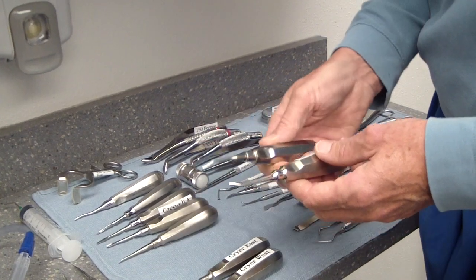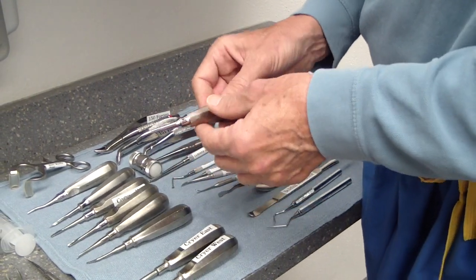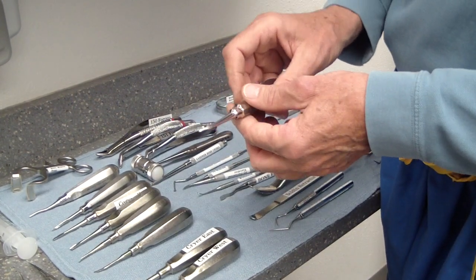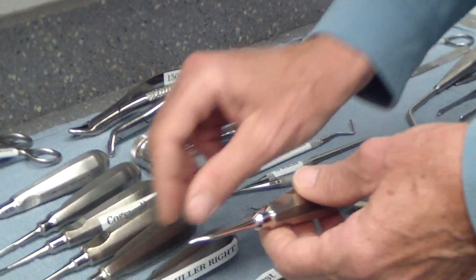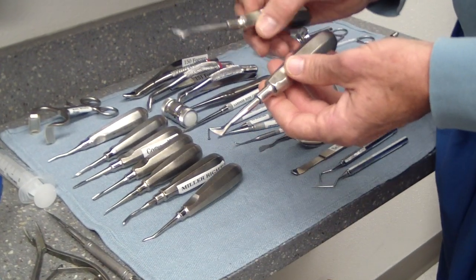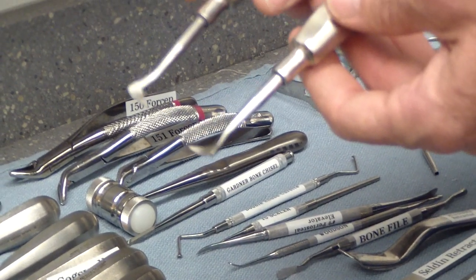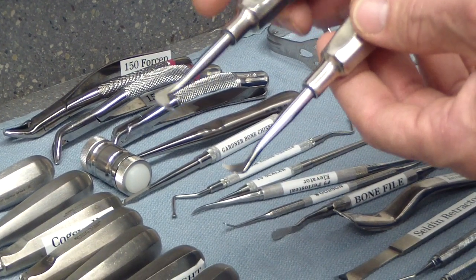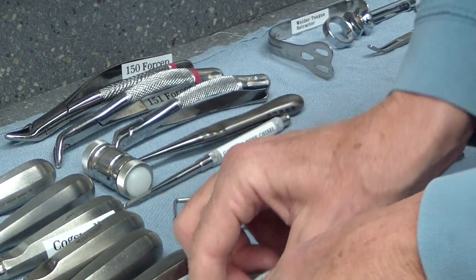Miller's left and right elevators are curved in opposite directions. They're good for getting out root fragments on mandibular teeth, and also for maxillary third molars where you don't deliver the tooth occlusally but bring it out to the buccal side. The East and West instruments are great for mandibular broken-off root tips — you can get through the opposite socket, so if you have a mesial root tip retained, put the instrument through the distal socket and elevate out the mesial, or vice versa.